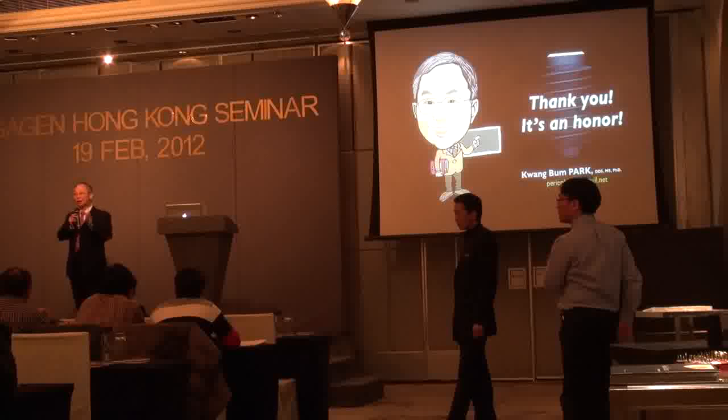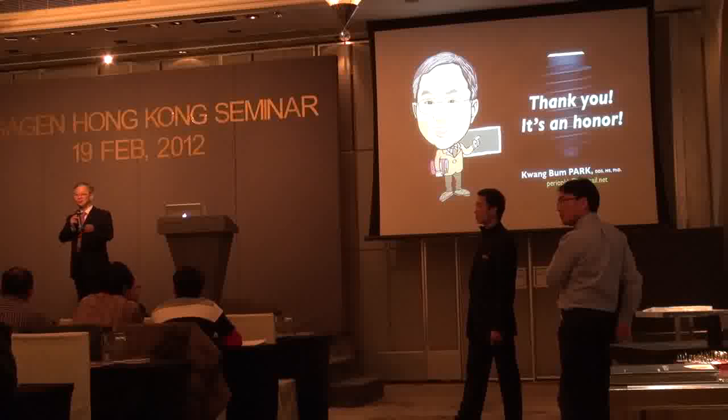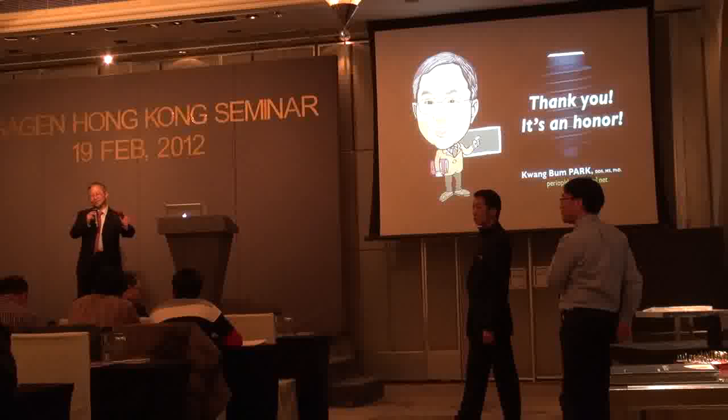So on hard bone, the same diameter. In soft bone, you can decide. You can start from the minimum. If you use ridge split techniques, it's only 2 millimeter, isn't it? With 2 millimeter, you can start to place wide diameter implants. So it's up to you. Very ridiculous, but to me, as a dentist, we should decide. That's the basic concept of the drill sequence. It looks a little bit vague.